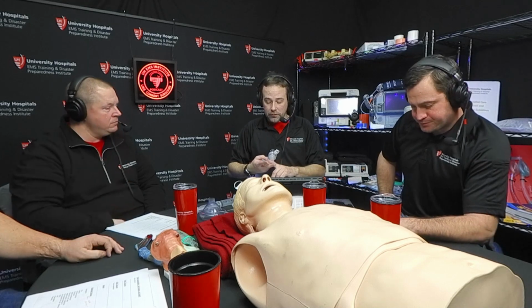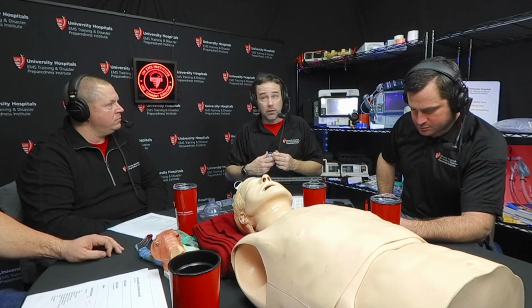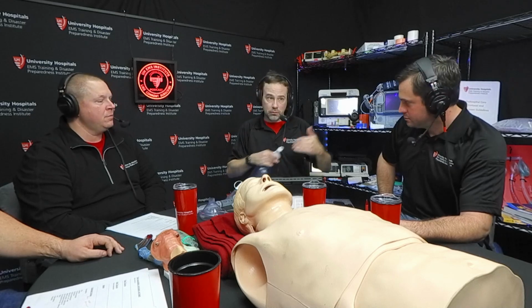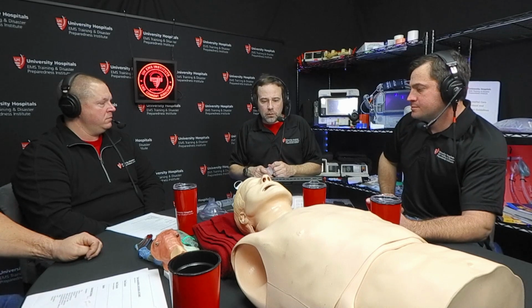And the second is if your organization is ever taking anybody on a ventilator and you have to strip the ventilator. The chances are that patient is on some level of PEEP on that ventilator. Almost exclusively, right? Very few cases I've taken were on ZEEP or no PEEP. They're almost always on PEEP.